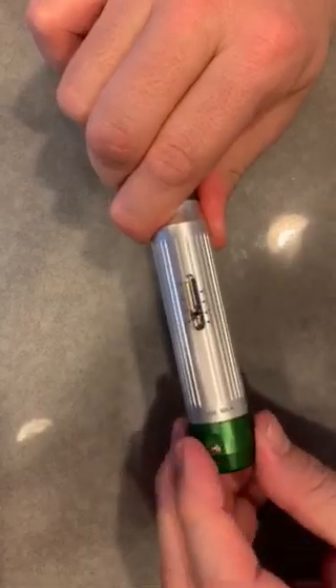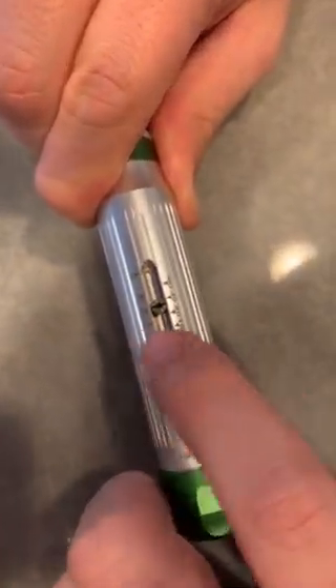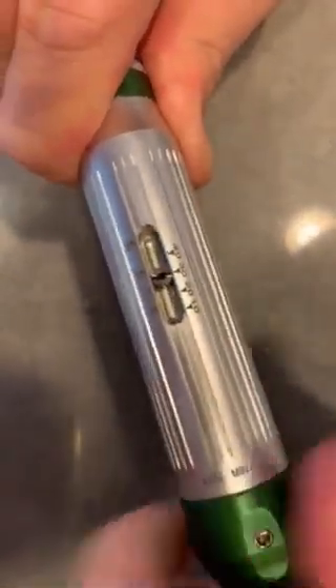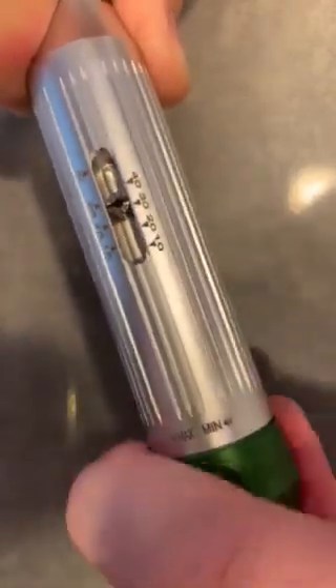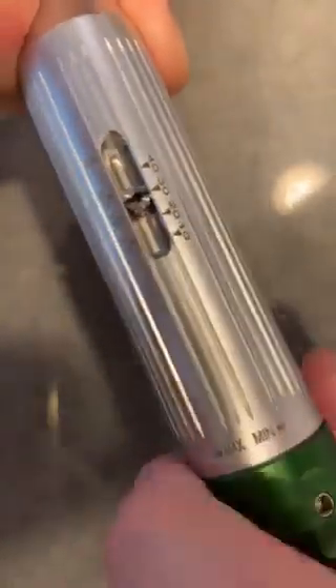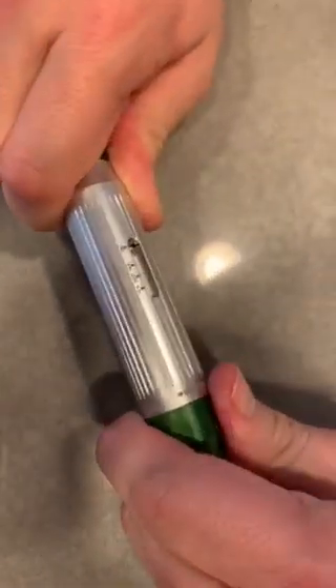the grid knob turns towards maximum rotation to increase the torque. You can set it at a certain torque by turning it towards the maximum orientation. If you want to reduce it, go towards the minimum rotation. You can see the indicator moving up and down to set the torque. The infinity setting means there's no torque limit, so it functions like a ratchet — you can use it as a ratchet function as well.